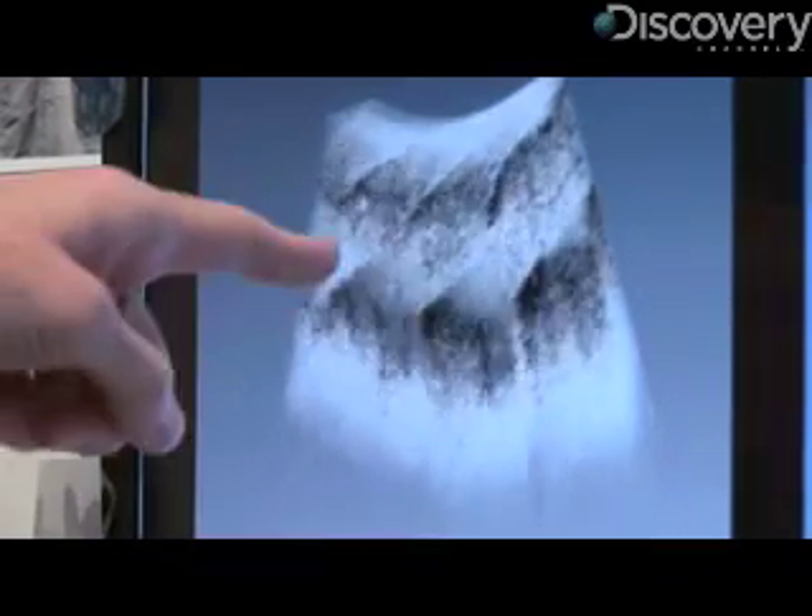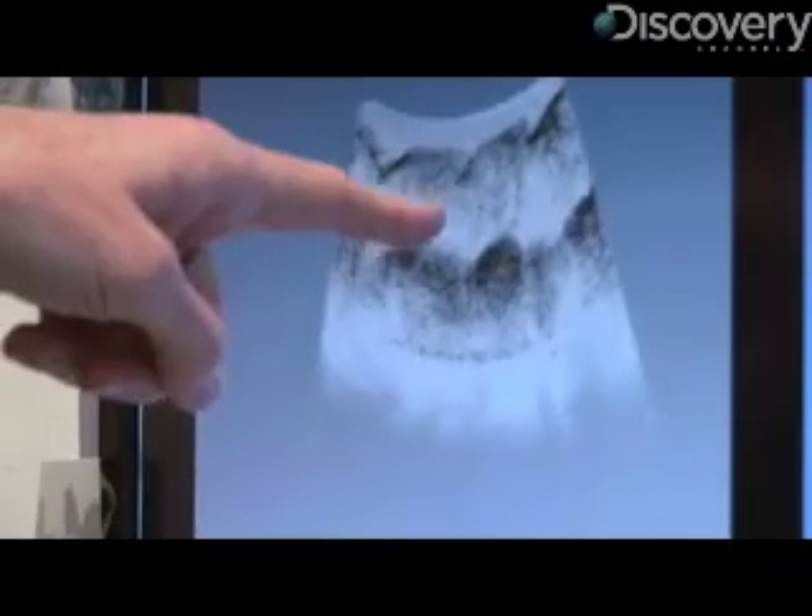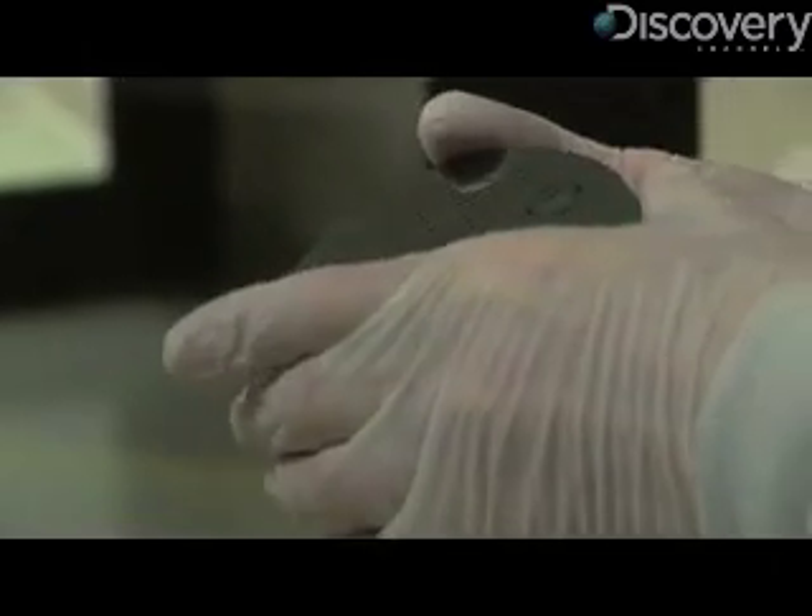With our endoscope, we have a single laser beam that goes in, and then we scan it back and forth. What our MEMS mirror does — the micro-machine mirror — is it's the scanner. That's what we're making here at Draper: the micro-mirror that does the scanning.